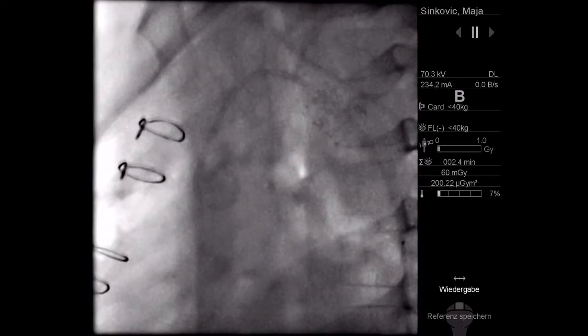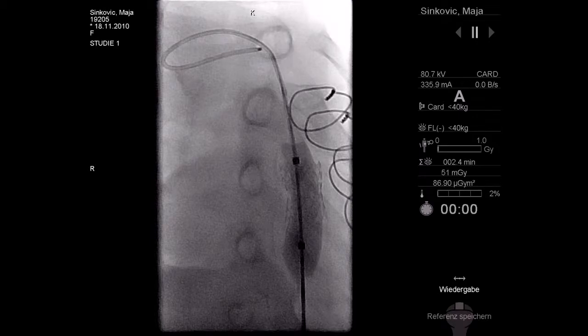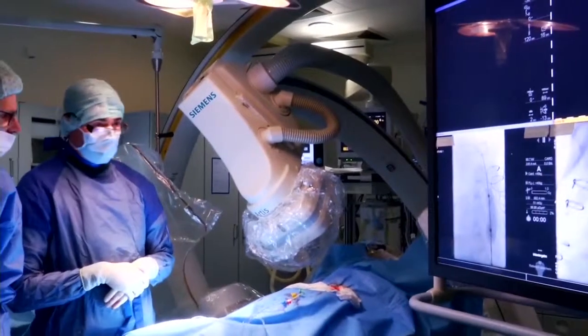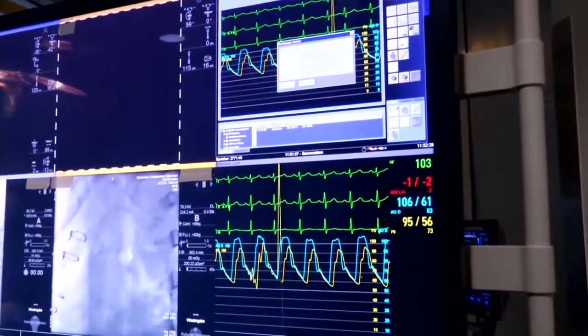Okay, here we go. And flushing blue, please. And flushing yellow. Then we have simultaneous blue and yellow on the screen. We can show it to the camera, perhaps. So there's still a gradient. We can flush it again. The gradient is 10.